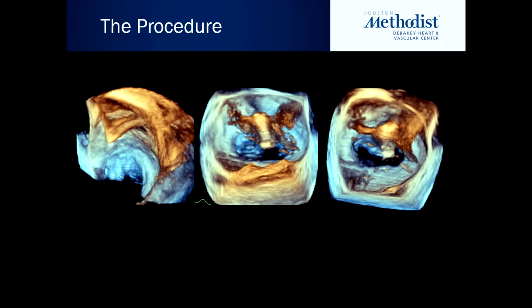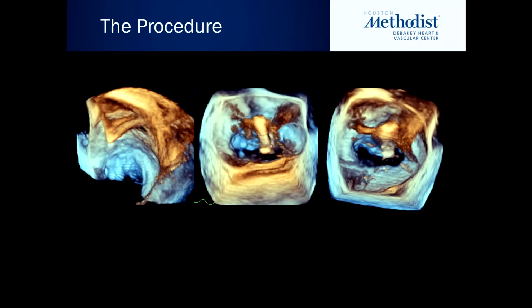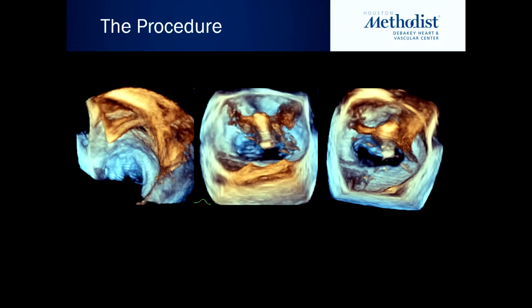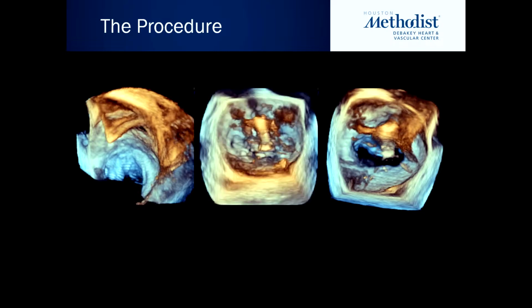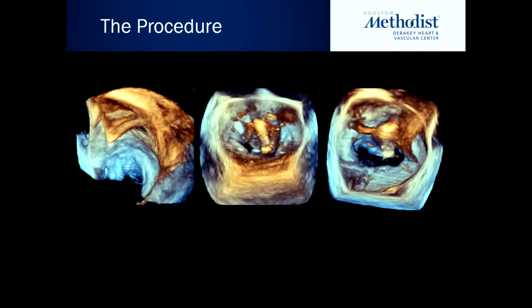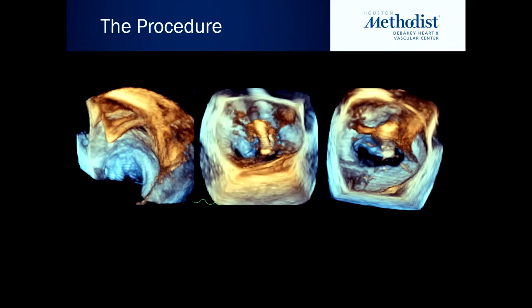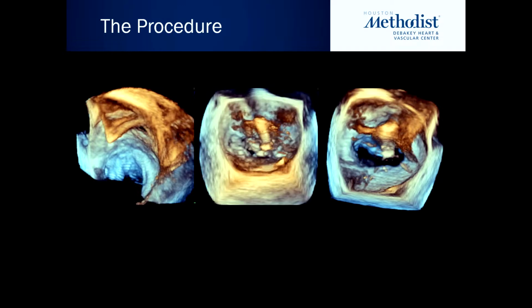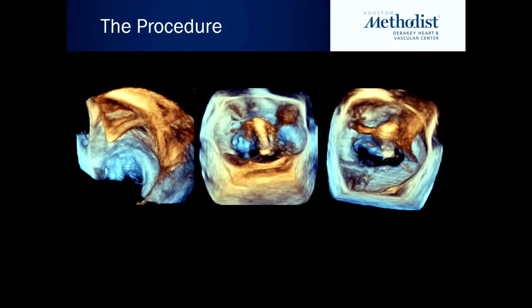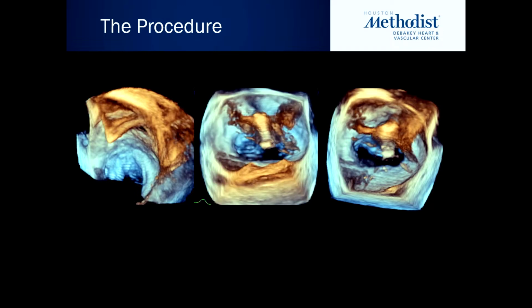Using 3D, we can also directly visualize the interatrial septum and make sure that while they're advancing, there's not a lot of tenting, and that they're going through the right trajectory and there's no tear. Once they get to the right spot, they open the clip and check the grippers, making sure they're working and which side is which. Then they move the clip down a little closer to the valve, making sure the orientation is good.